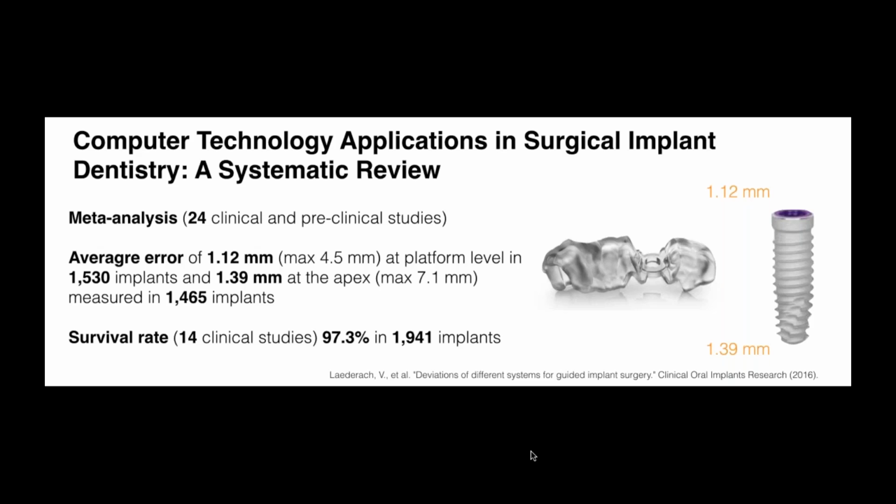Of course, making sure your intraoral scan is really clean, the CBCT file as well, patient is not moving, there's no distortion, so you can get a very nice correlation. Will help you minimize the error. I'm not saying that every implant placed with a surgical computer-guided surgery would be flawless, that there won't be deviation, but we can minimize the deviation by the quality of the information that we give to the software. So that's something very important to always consider.